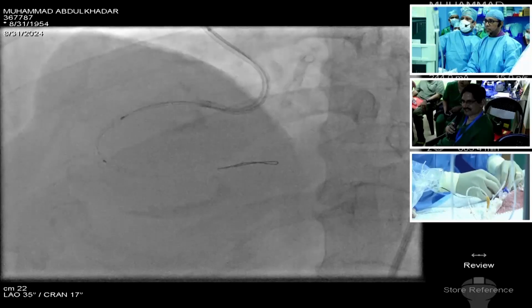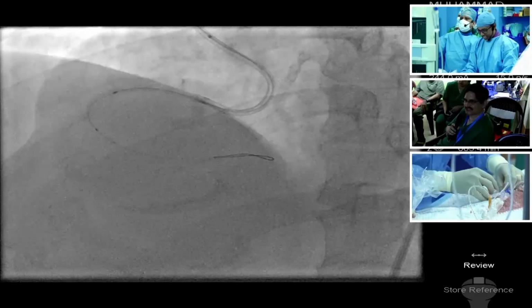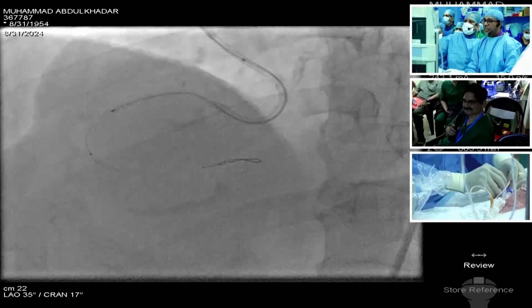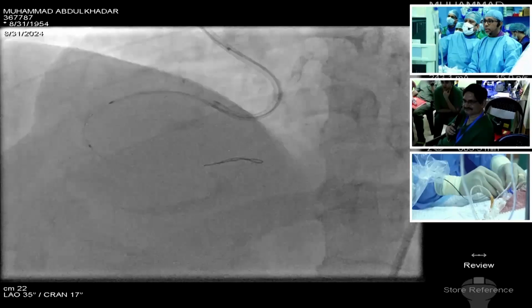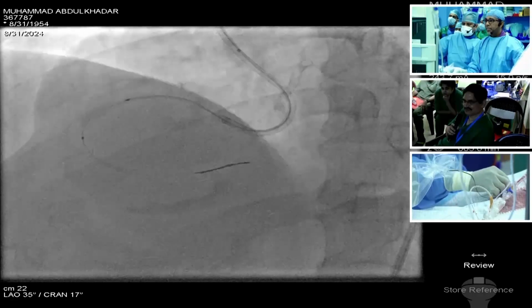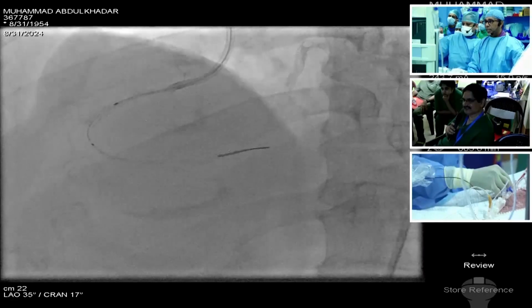I think we got some friction at the lesion. Yeah. Tight lesion. But it's gone halfway through, so we'll certainly try to do an imaging, at least a partial imaging. That's a good strategy.